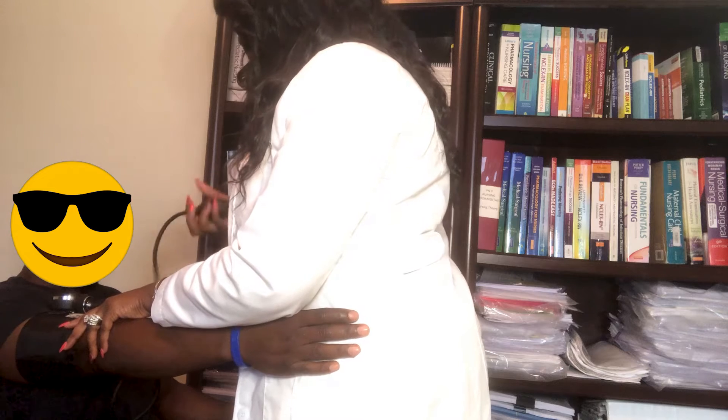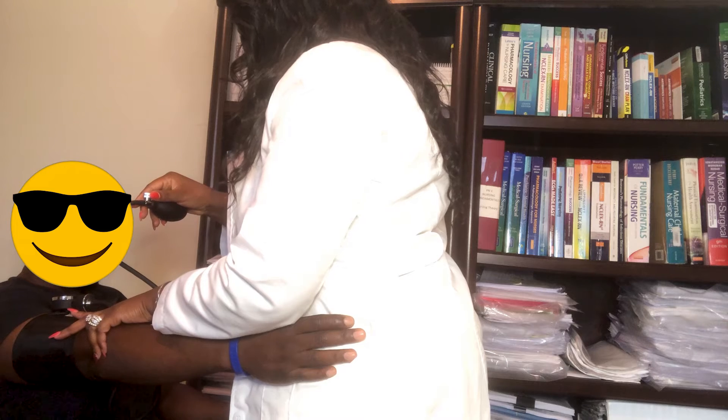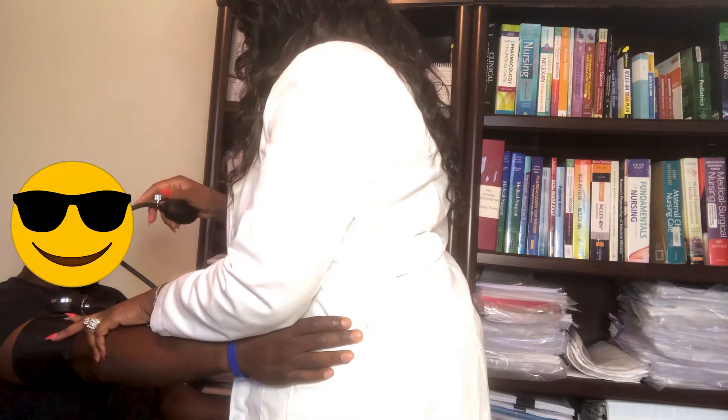Then you use the dial, turn it all the way back, and start squeezing. The cuff is supposed to squeeze the patient's arm. Squeeze until you reach resistance, then stop. Slowly let go of the dial — very slowly. The minute you hear the first click, that is your systolic number. Remember that number, then keep hearing the clicks — those are the heartbeats.